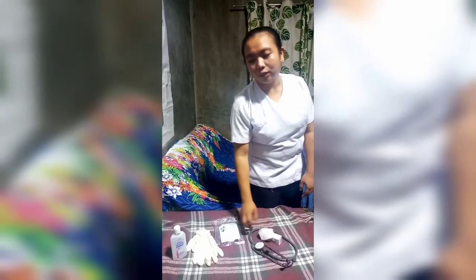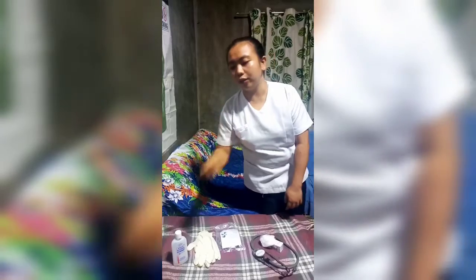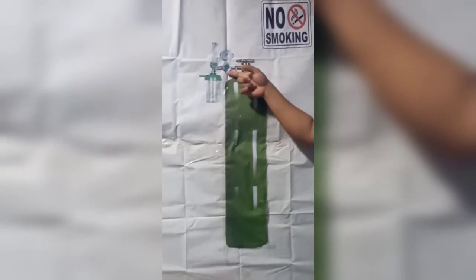a stethoscope, the PPEs, including the gloves and the mask, and alcohol for hand hygiene, or we can also use soap and water. We also need to have the oxygen tank and the oxygen regulator.